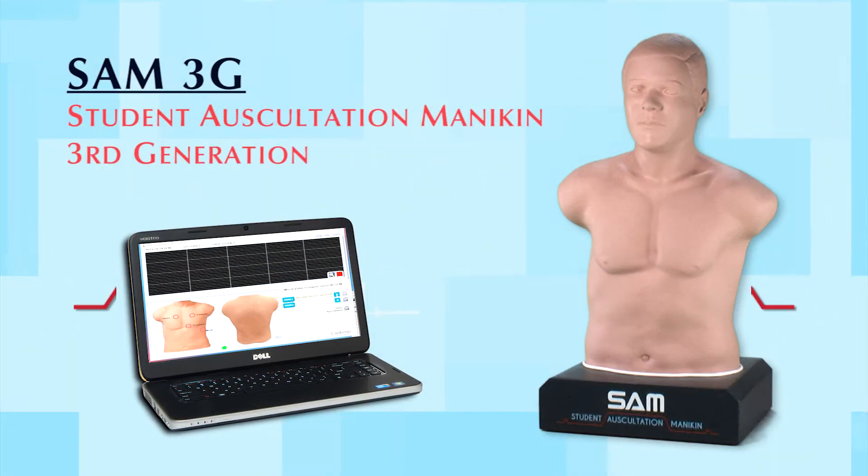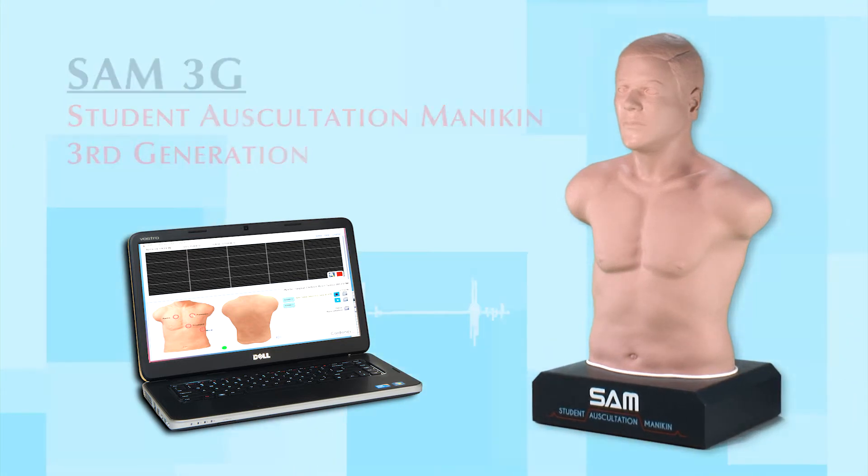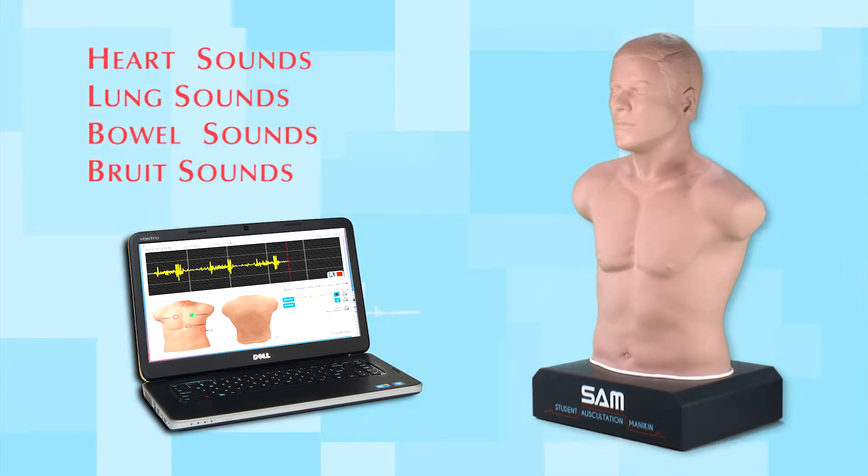SAM 3G, Cardionics' third-generation student auscultation mannequin, is the latest innovation in teaching and learning heart, lung, bowel, and bruit sounds.